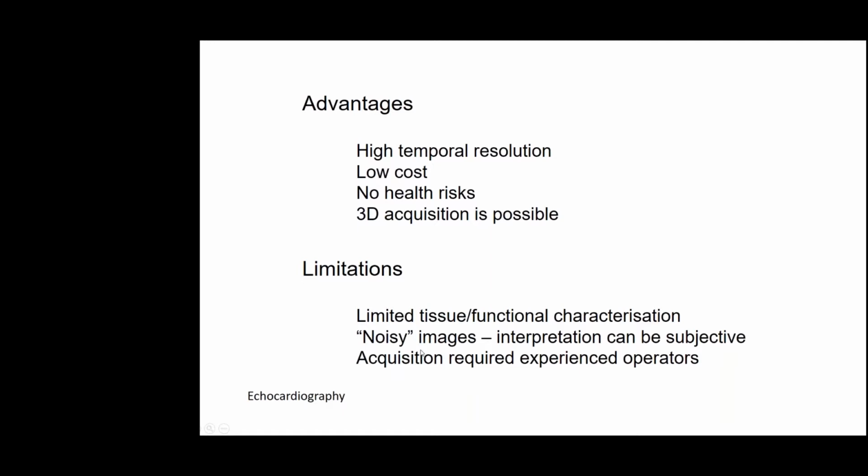I hesitate to put noisy images here, because this kind of speckly pattern can actually provide information. But it's true that the edges are not perfectly clear and the interpretation can be subjective. And the acquisition also requires experienced operators, because the probe has to be placed at the right position.